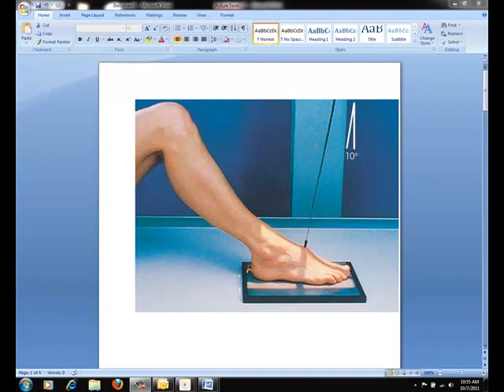For this, place the patient in a supine or seated position. Then, flex the knee of the affected side enough to rest the sole of the foot firmly on the radiographic table. Once the foot is centered to the IR, direct the central ray 10 degrees toward the heel, entering at the base of the third metatarsal.